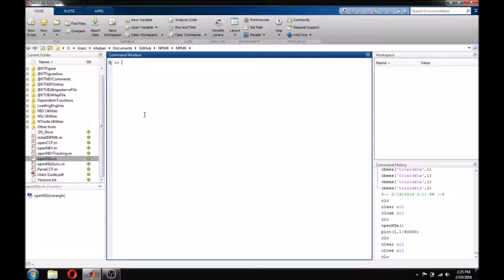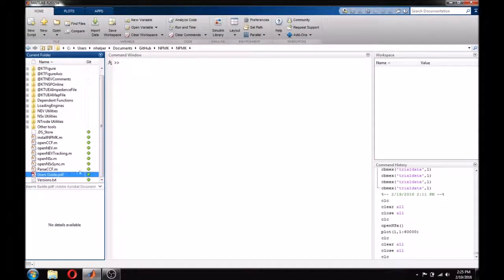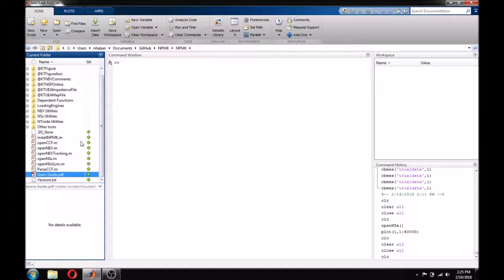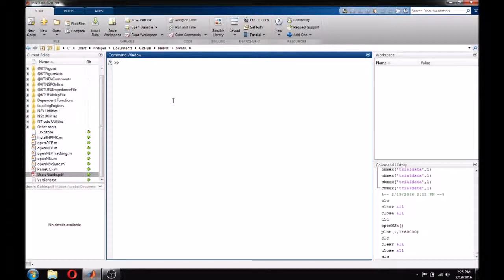All functions within the NPMK have extensive help documentation that describes each of the available parameters. That said, all parameters of both OpenNEV and OpenNSX are optional, so we will try to start by simply loading a data file without any special parameters.